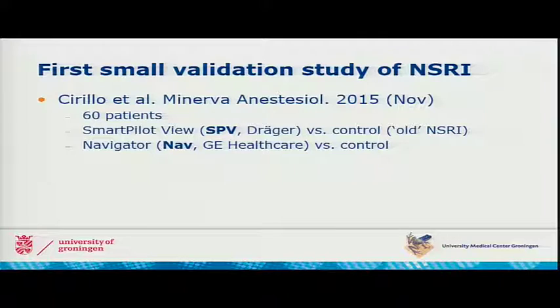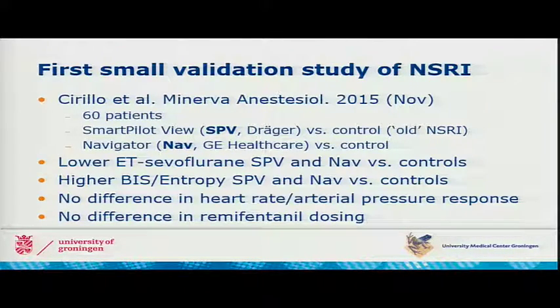An older version of the NSRI, which uses data from the 3 individual studies, is currently incorporated in the Smart Pilot View by Dräger. The Navigator by GE Healthcare also incorporates several interaction models, with the exception of an interaction model between propofol and volatile anesthetics. A small validation study by Cirillo et al. in 2015 was performed using only sevoflurane and remifentanil in 60 patients. They found that the use of either monitor resulted in lower sevoflurane end-tidal concentrations and higher BIS or entropy within what is considered the therapeutic range, without any differences in hemodynamic responses during surgery.